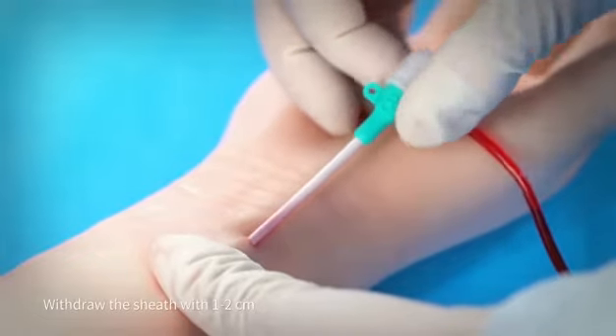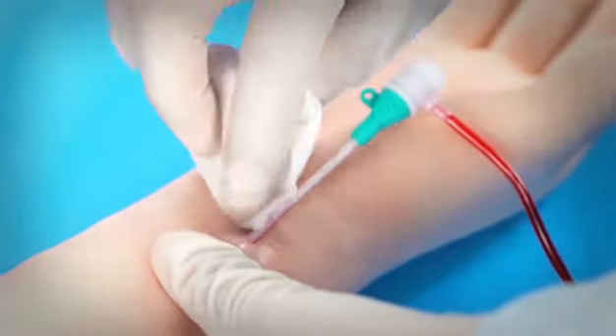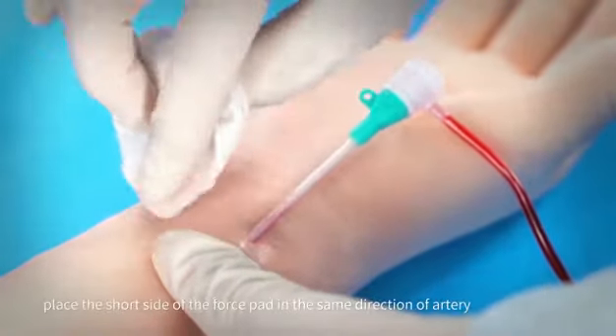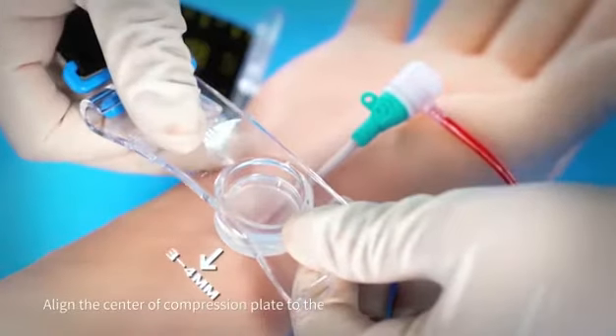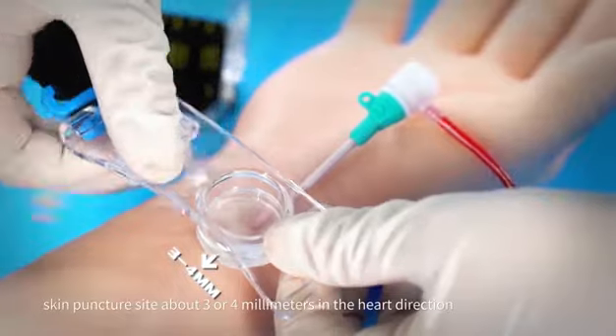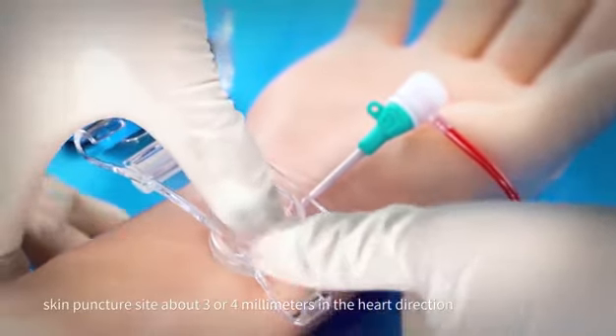Withdraw the sheet 1 to 2 cm. Place the short side of the force pad in the same direction as the artery. Align the center of the compression plate to the skin puncture site, about 3 or 4 mm in the heart direction.